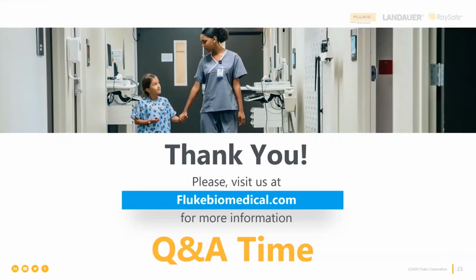Other AEDs have a battery separate from the pad, but you're going to need your own battery because it's not okay to use the clinical battery, because that clinical battery has a limited number of discharges that it can provide power enough for. And so what you're going to want is to have a spare battery for however many brands and models of AED that you're going to need to test. So it's a little bit bigger problem if you're a field service engineer that has a lot of client sites and they each have different brands and models of AED. You're going to have an assortment of those things. The good news on that. Yeah, go ahead, Justin.